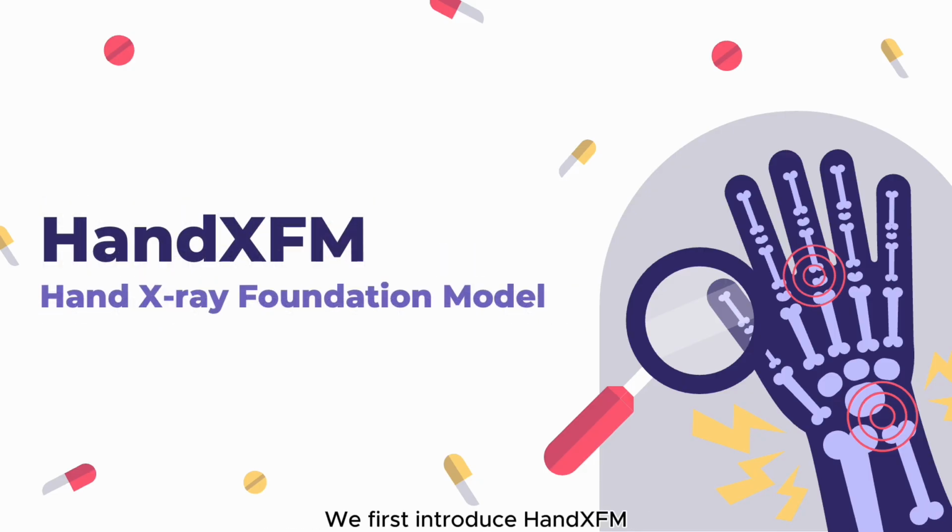We first introduce HandXFM, our domain-specific foundation model for hand X-rays, which learns comprehensive musculoskeletal representations by integrating semantic and structural medical knowledge through cross-modality distillation.